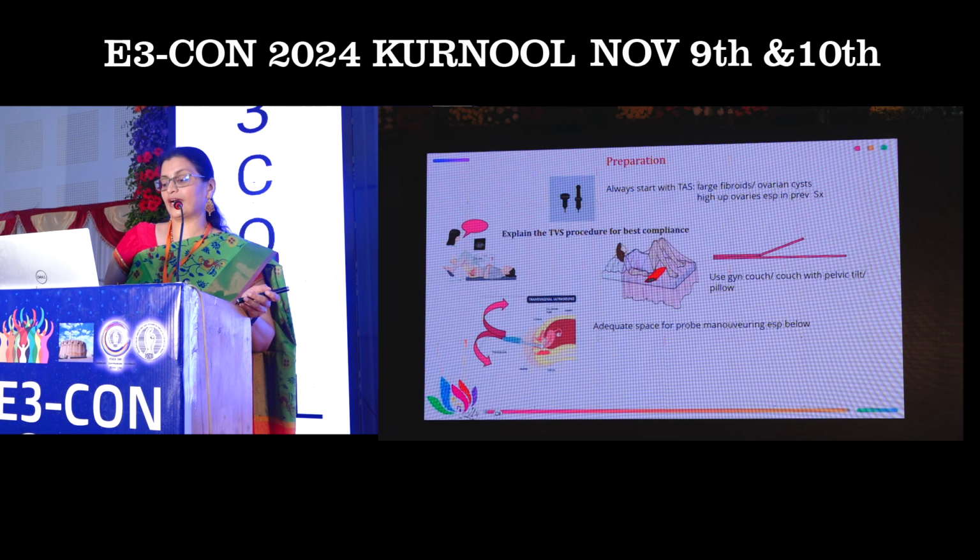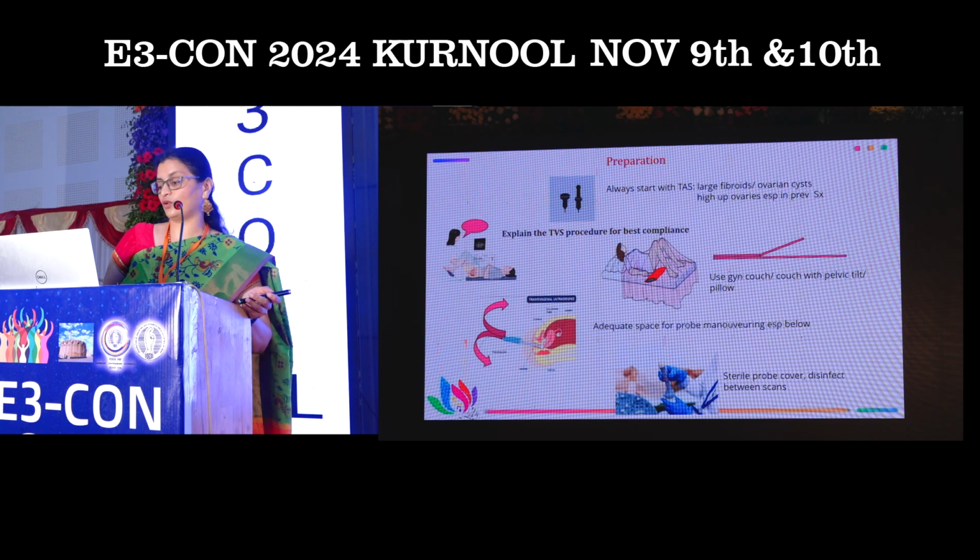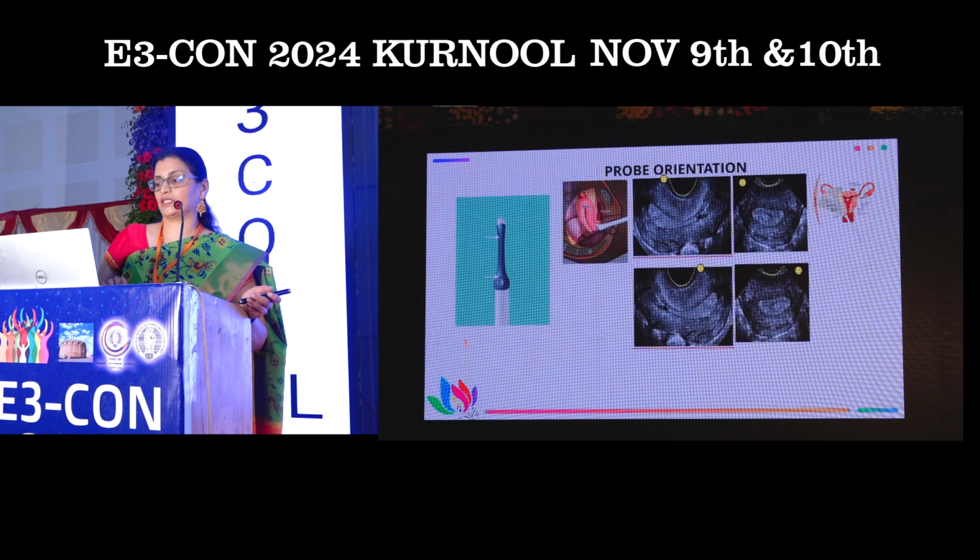This is what I've said. You need adequate space for maneuvering your probe, especially in the lower part. So you need the pelvis part to be lifted up. And always for transvaginal scan, use sterile probe covers and also disinfect the probe between the scans.